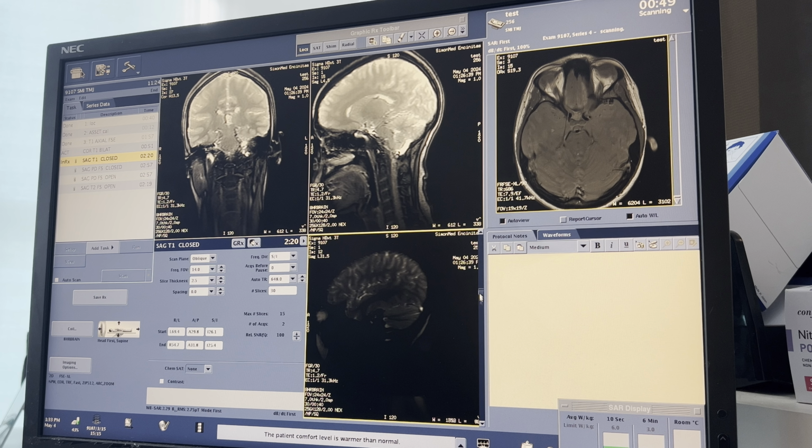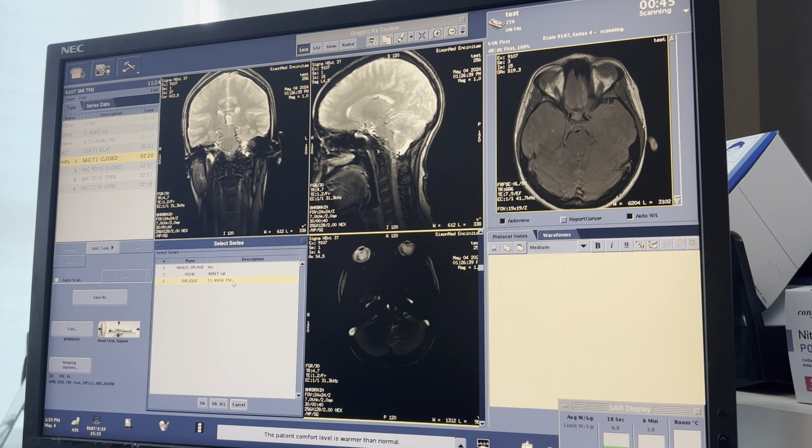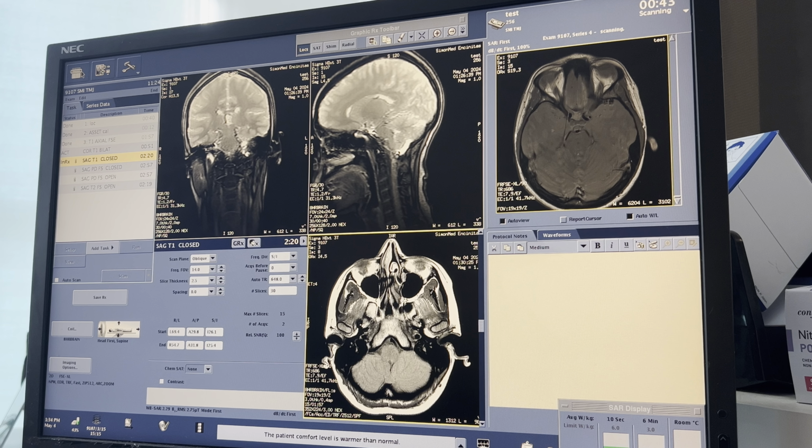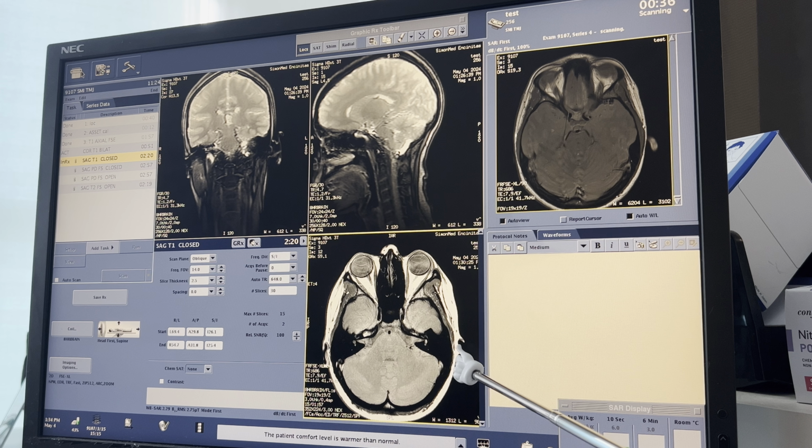So this is series 1 right here, meaning it's the localizer. So yeah, let's bring up the new Axial. Perfect. So I never showed you guys Shrek, so let's scroll down. I'll show you Shrek real quick. One more. There you go, there's Shrek. Kind of looks like a snail here, but you have like Shrek's head, his ears right here, which are the IACs. Yeah, there's like neck and shoulder.